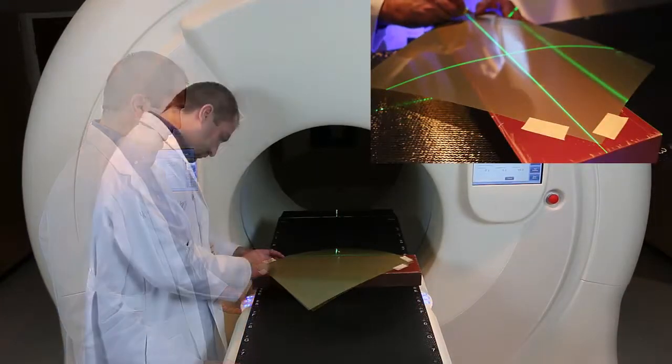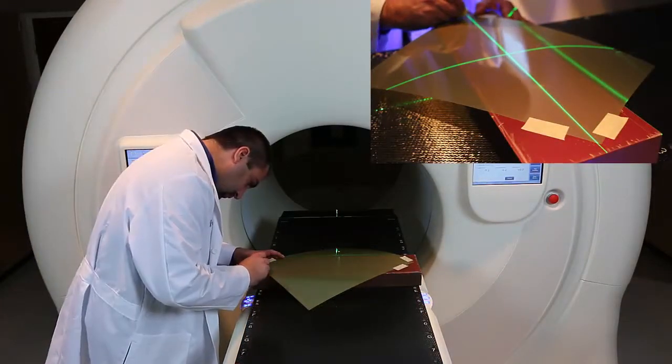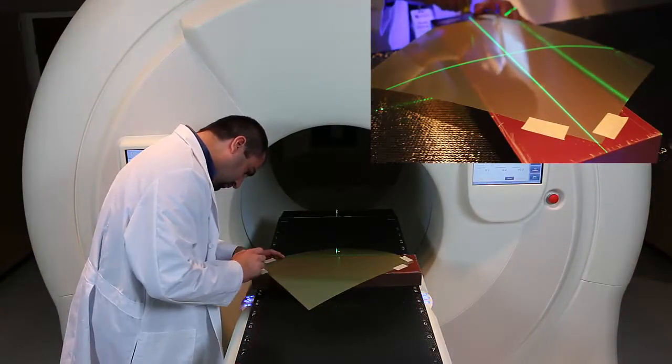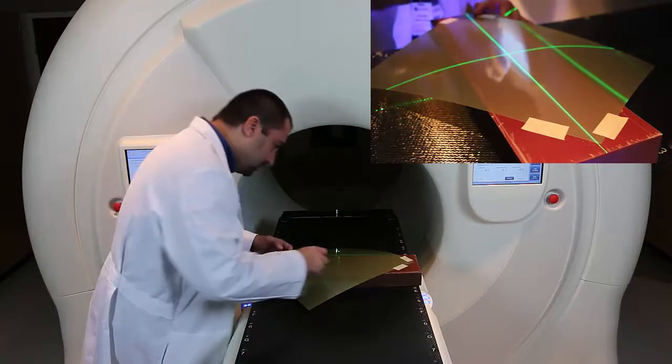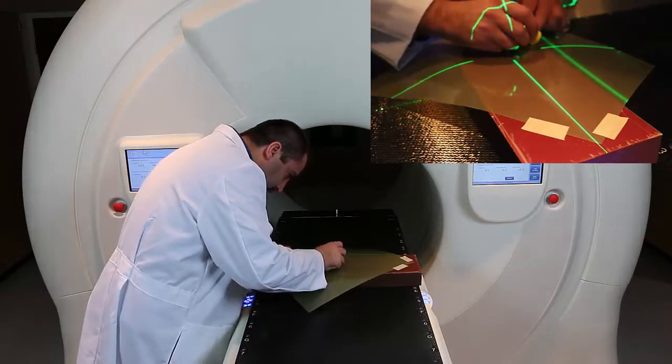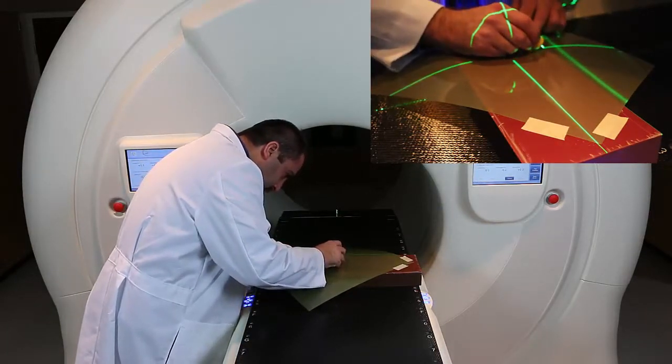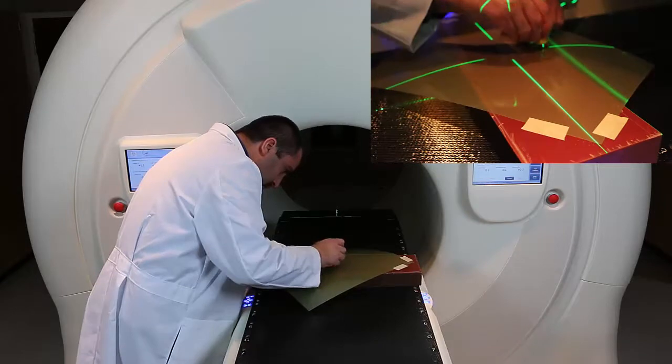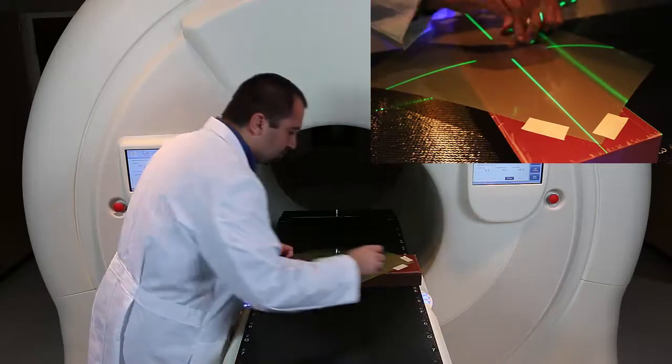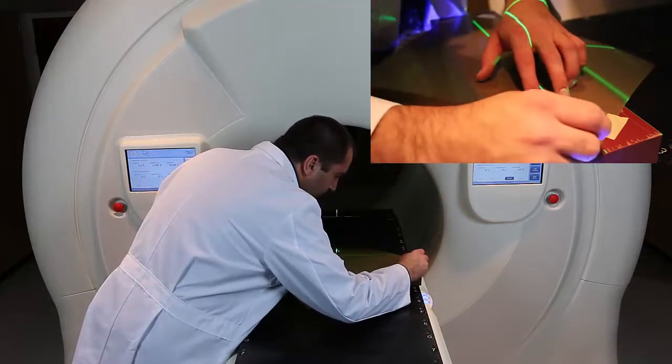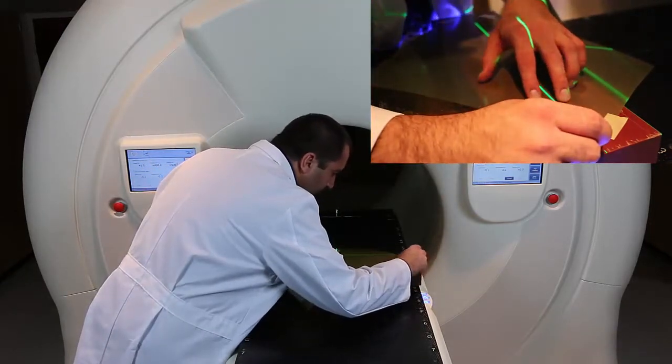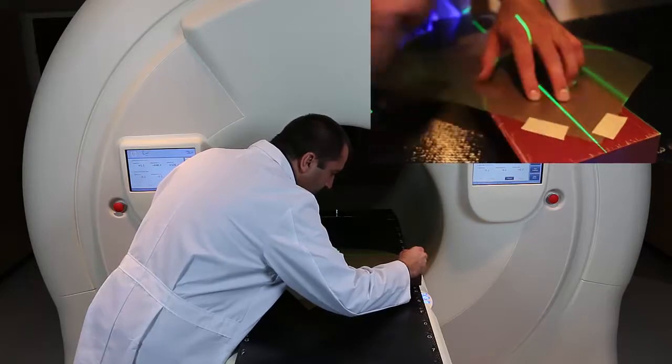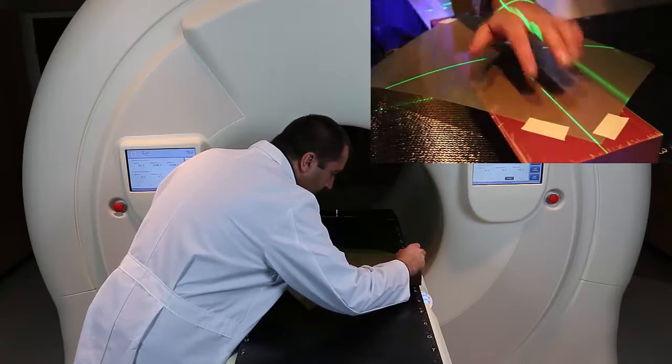Pull the film back out of the bore until the green lasers are approximately in the middle of it and then use a thumbtack to put either three or four holes in the film in the center of the green lasers.